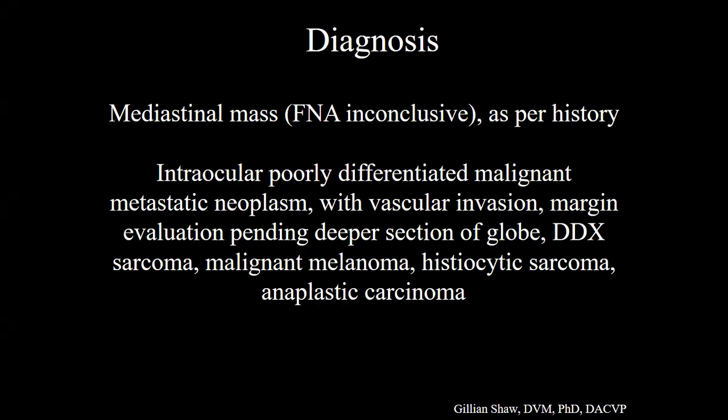But it's complicated because at the same time, we don't want to mislead people in terms of how far we can get with the diagnosis by doing just more tests, you know. I did suggest if we did pursue IHC to start with the basics. So I suggested vimentin and cytokeratin, which would differentiate mesenchymal from epithelial, sort of, sometimes.